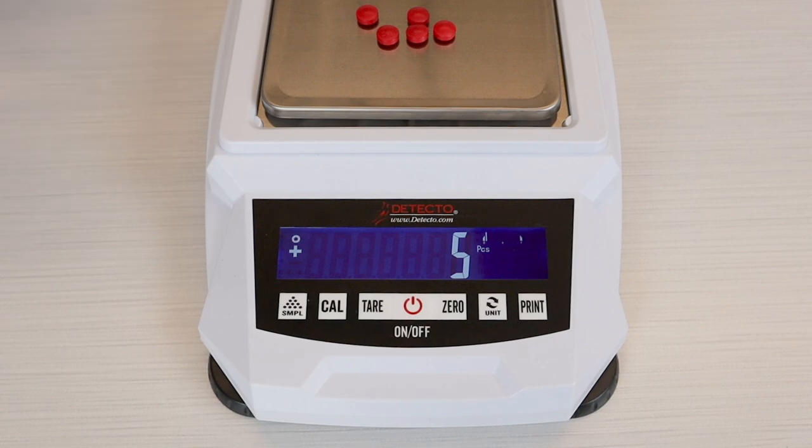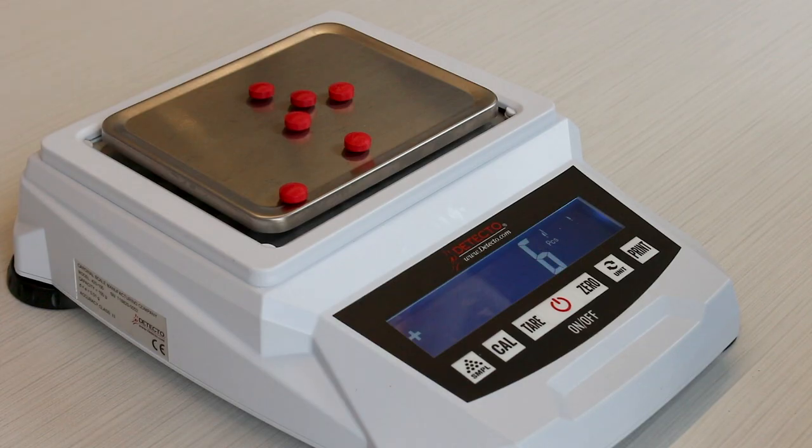The sample parts counting button is used if you want to do a piece count for calculating the total number of parts weighed on the scale.